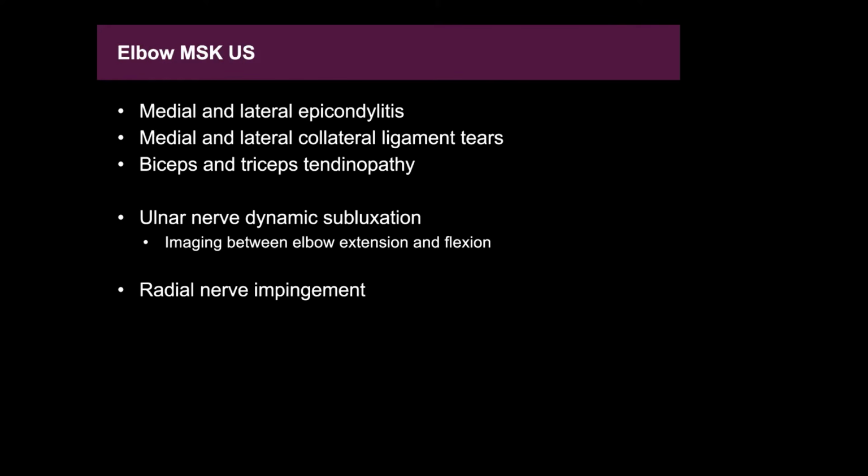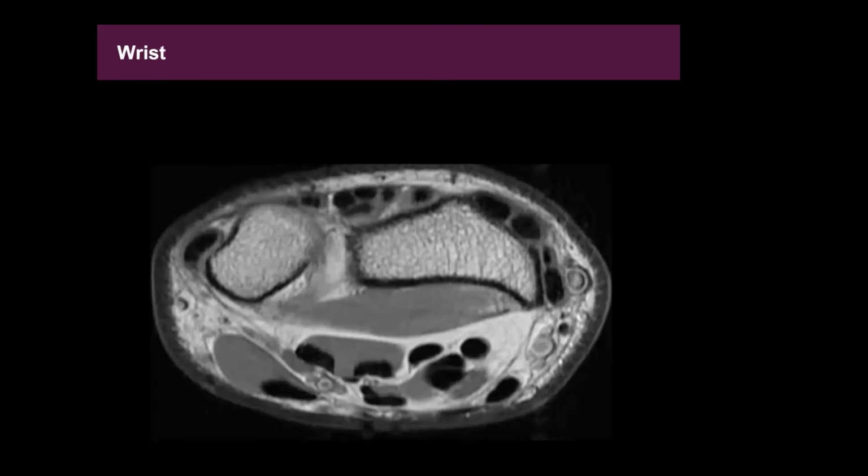And pretty painful for the patient. Yeah, it can be, but it's something that's pretty difficult to diagnose with MRI because the patients are usually in full extension, so we just can't see the subluxation with MRIs. So ultrasound could certainly be a good modality to use in these patients.